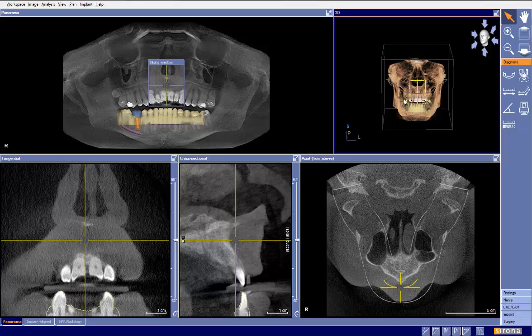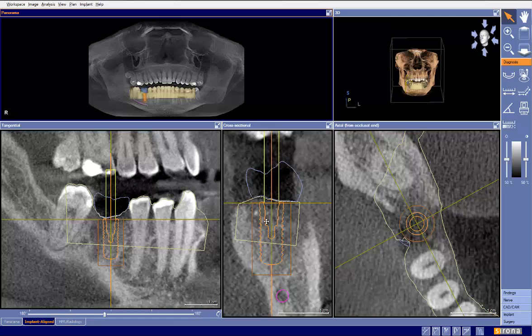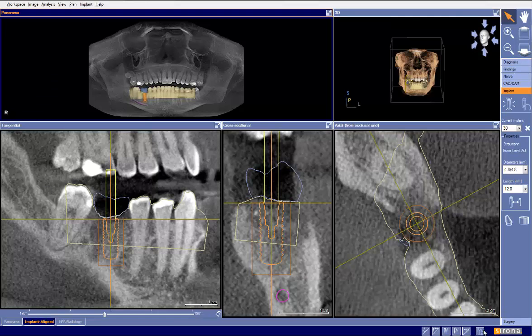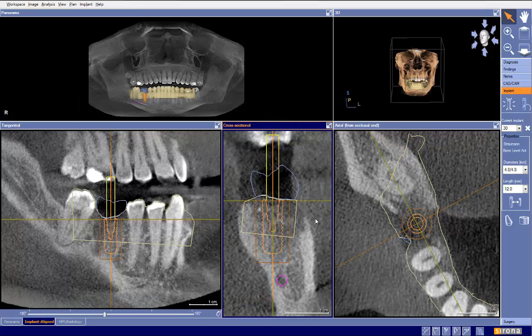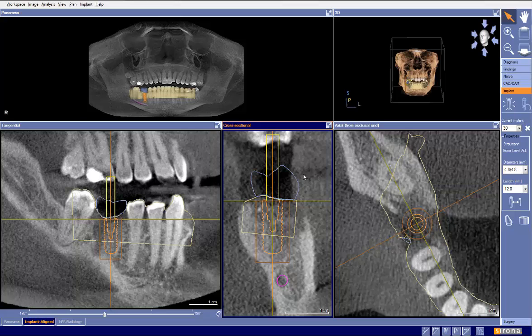Let's take a closer look at it. The first thing we'll do is go to the implant in-line view. We can see our implant has been planned as a Straumann bone level implant, a 4.8 by 12 — certainly more than adequate in length. I would like to see a slightly wider implant, but 4.8 and 5.0 is not a big difference, so we'll certainly go with that.